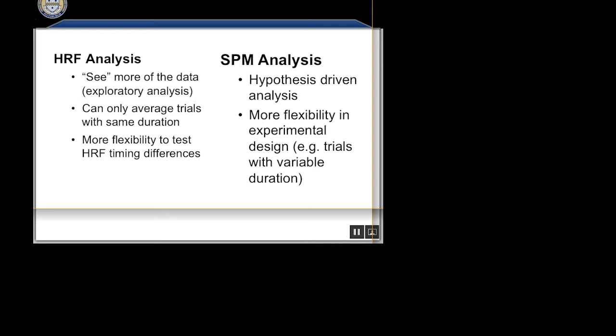Of course, if you brought it to your statistician, the first thing they would have asked you when you entered their office was, what time window do you want to use? Yeah. So there are a couple of different strategies, right? Presumably you have some set of contrasts that you're interested in. And I understand completely that you might want to go in and say, I'm going to define my time window up front. Yeah. But the question is this.